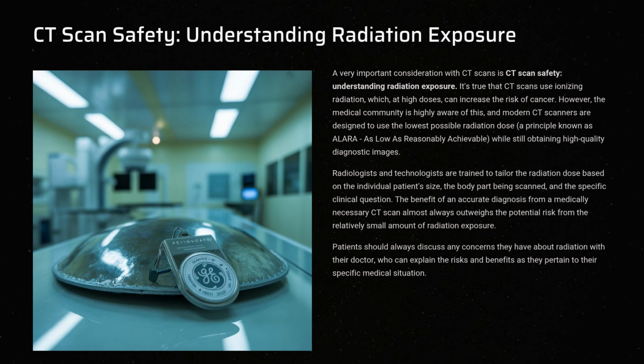Radiologists and technologists are trained to tailor the radiation dose based on the individual patient's size, the body part being scanned, and the specific clinical question. The benefit of an accurate diagnosis from a medically necessary CT scan almost always outweighs the potential risk from the relatively small amount of radiation exposure. Patients should always discuss any concerns they have about radiation with their doctor, who can explain the risks and benefits as they pertain to their specific medical situation.